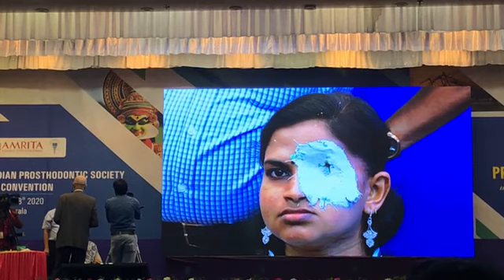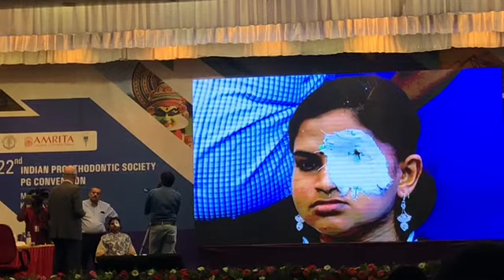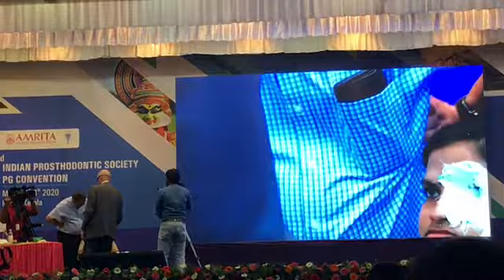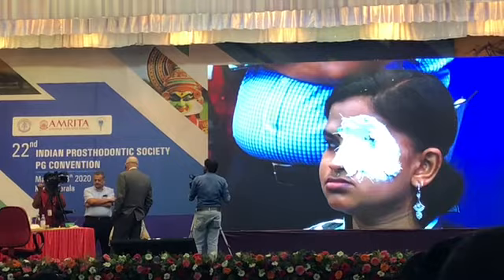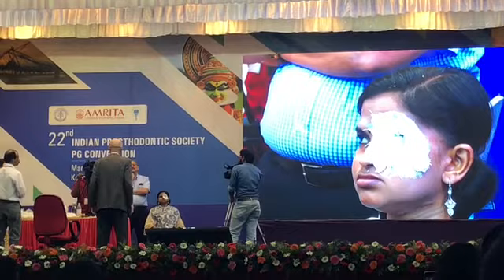Anything the heavier and thicker the impression material, the more distortion of the tissue. So when you're using, say, a little light body and then you inject some heavy body, you've combined both of them, and now the thickness of that material is going to weigh on the tissue and push the tissue. So when this gets hard, then you can apply anything you want. But you have to wait for that to get hard. And so this has to be thin. We would not use a medium body material to start with. When you mix light and medium, it becomes medium, in a sense, because of the thickness and weight of the material. So that's not going to work. Not a good idea.